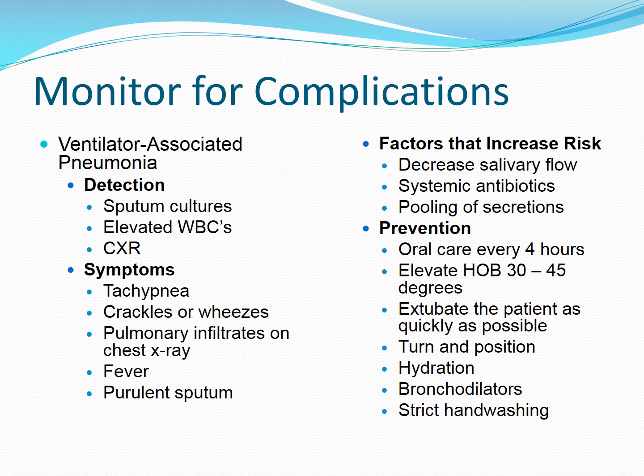So pulmonary hygiene is extremely important, which is that turning and positioning and hydration and those bronchodilators. So we really need to do strict hand washing before and after suctioning. You need to make sure you wash your hands before you touch any of the ventilator equipment, those kinds of things. So that's something that we need to think about, is monitoring for these complications.